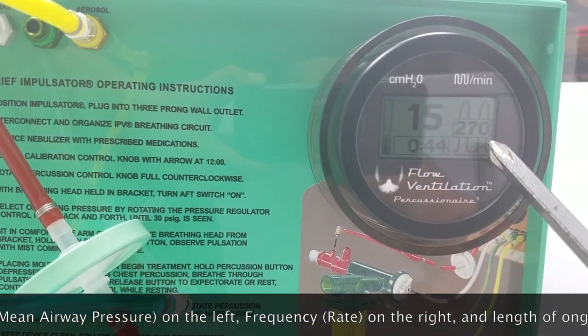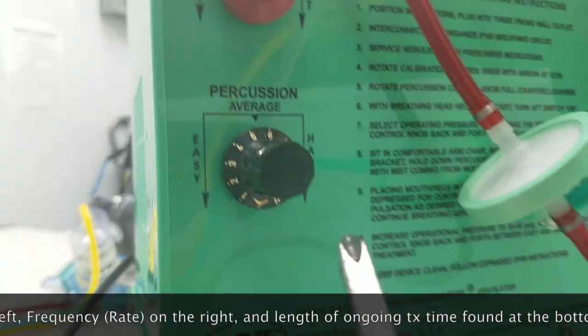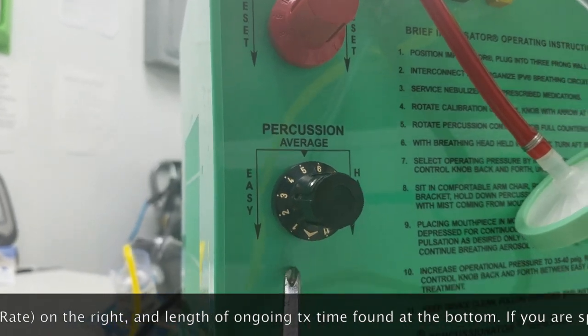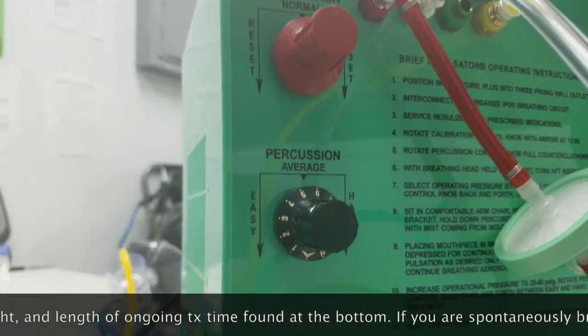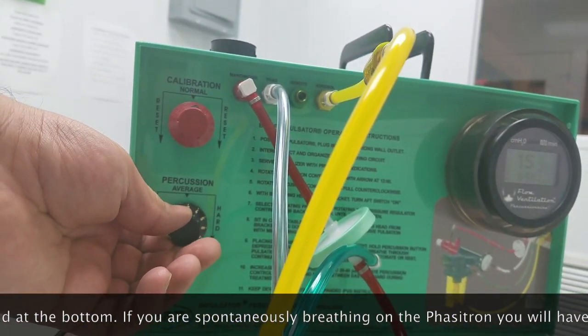Currently we're at about a MAP of 15. We have a percussive rate of about 270. The timer was at somewhere around 45. That's all happening with the arrow at 6 o'clock on our rate — or full counter-clockwise — at 40 PSI.